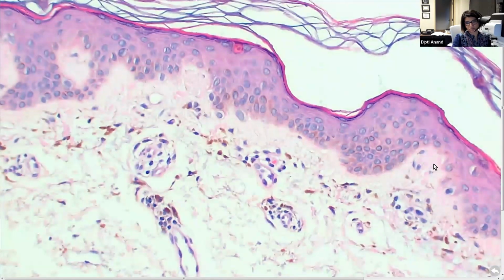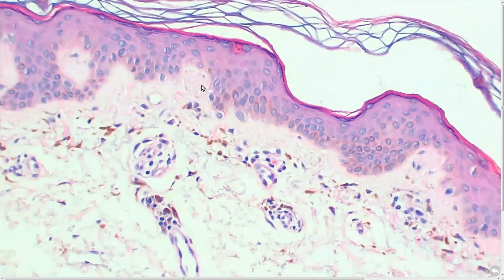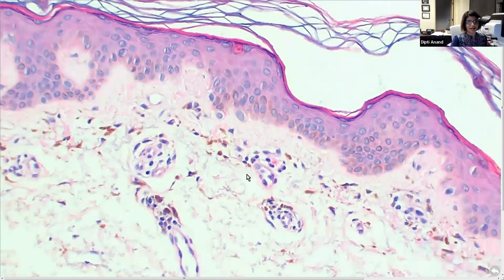There's a little bit of amyloid. Amyloid. Yep, so that's macular amyloid. And the pigment incontinence is always a clue. We always see that in macular amyloid. That's because, as I said, I really believe that friction and rubbing and the damage of the keratinocytes with the leakage of melanin pigment is essential for this disease. So you can see the macular amyloid with the pigment dropout. Good.